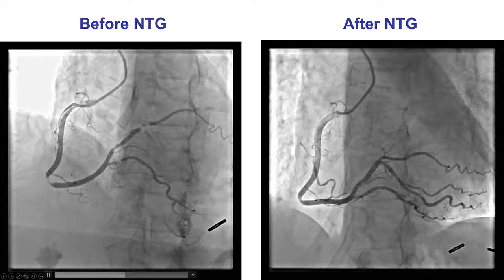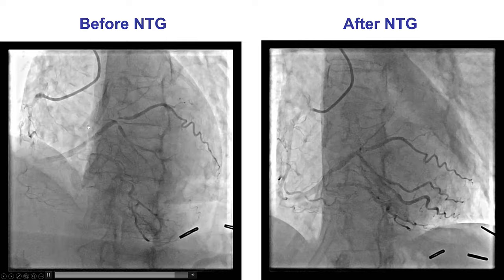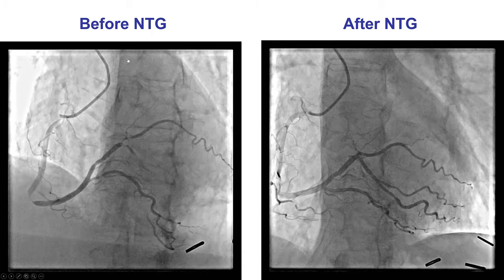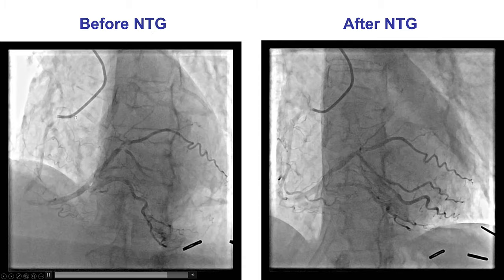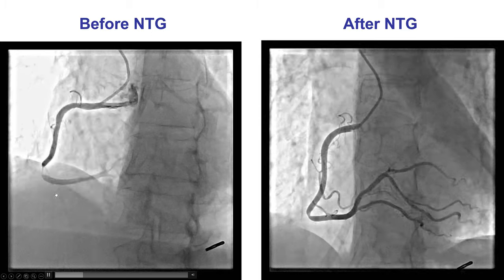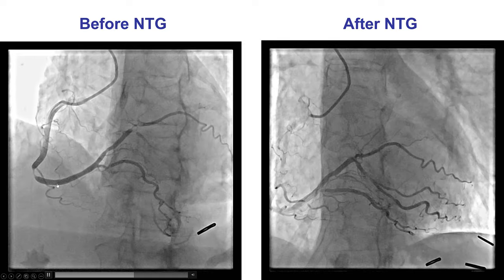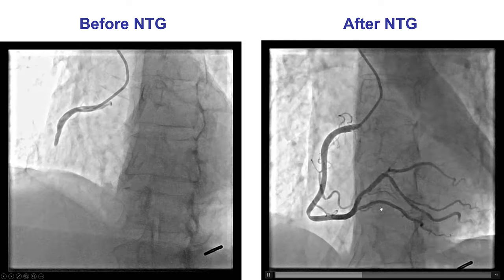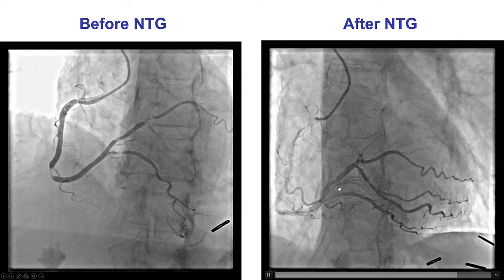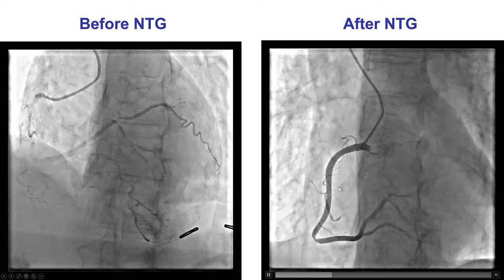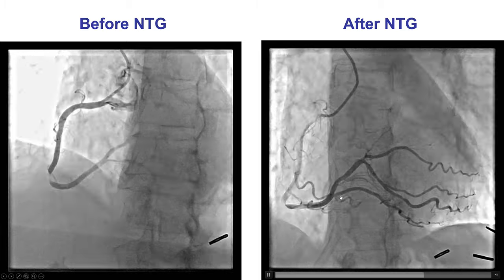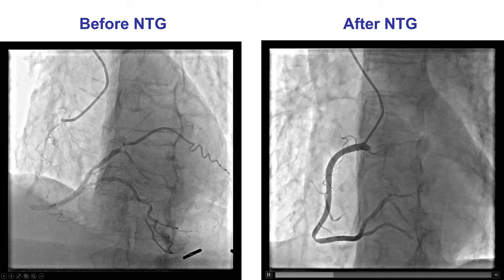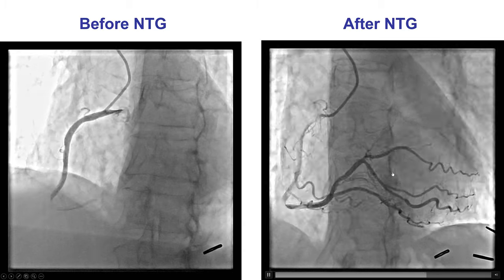Another key piece of information before assessing the coronary artery is to know whether nitroglycerin was given. This is an example of multifocal spasm where multiple lesions resolve after nitro is given. That is why every angiogram should be done after nitroglycerin is administered, to avoid falsely calling stenoses that are not present but simply represent spasm.